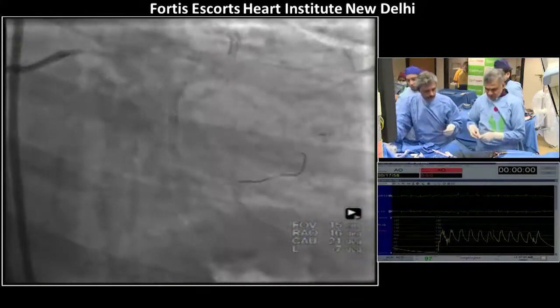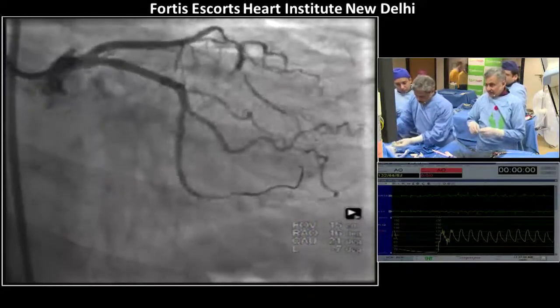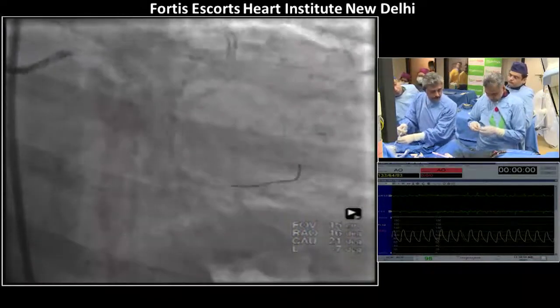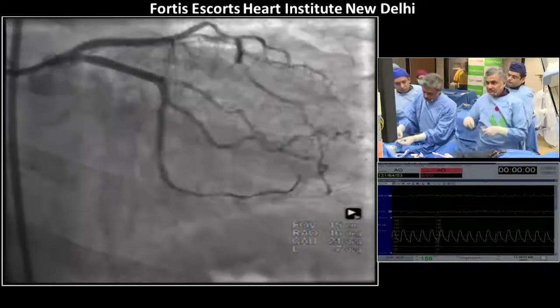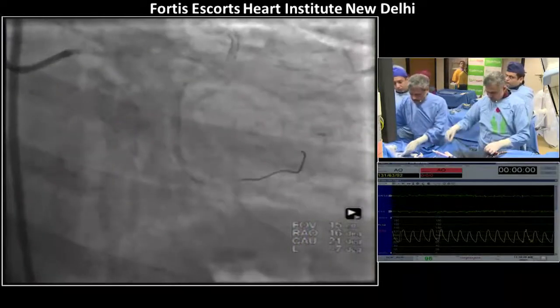We'll flush your IVUS. Flushing. Let's check whether you have a cover. All right.